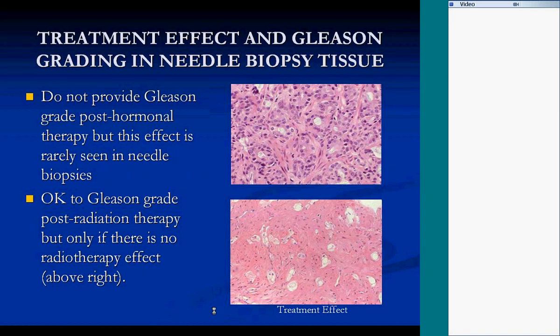Now, treatment effect can definitely impact the appearance of prostatic carcinoma and can often make the carcinomas appear much higher grade than they actually are. And this is true for both hormonal therapy as well as radiotherapy. And so basically, just uniformly, with one exception we'll mention in just a second, one should not provide a Gleason grade post-hormonal therapy. And we'll show an example of that in TUR chips in just a second. But usually we're not going to see that in needle biopsy tissues. That is, patients treated with hormones and then those patients undergo a subsequent needle biopsy.